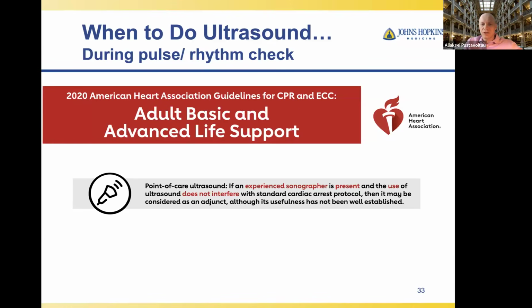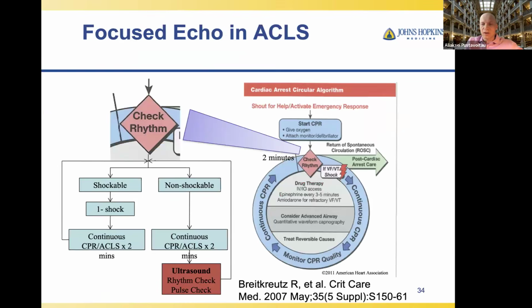Then it may be considered as an adjunct, although its usefulness has not been well established, right? So you have to use it by the right person and in the right way, and you may still get supporting information, but we really need to investigate more. And as more and more people start using it, we will get more information and we will understand, does it help? Does it hurt? There is some literature that it may actually hurt by extending the pauses that people do for pulse and rhythm checks.